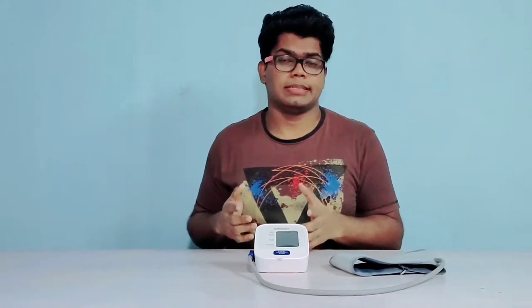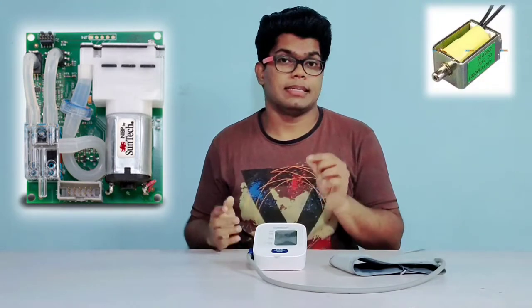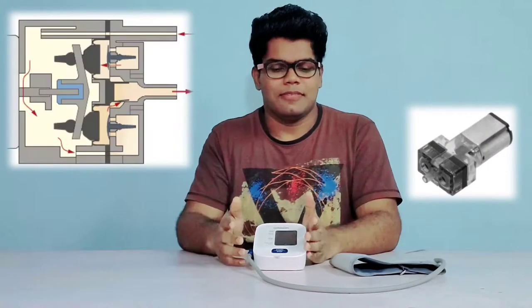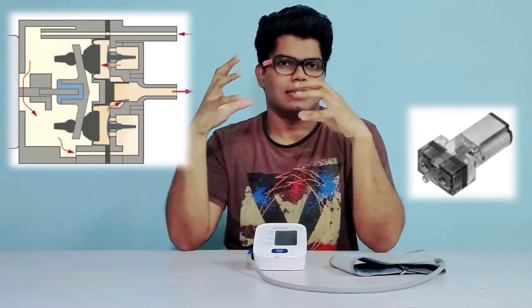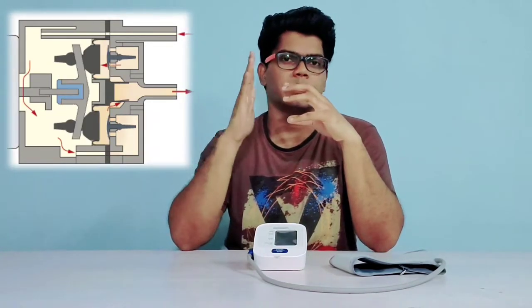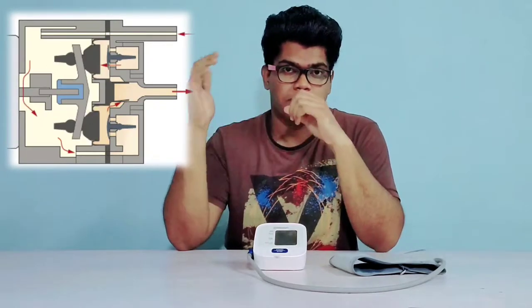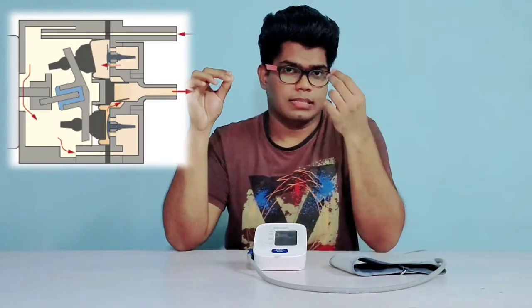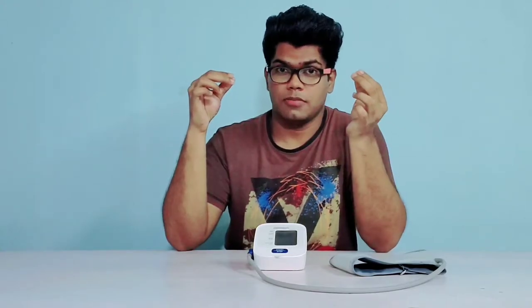Inside a typical blood pressure monitor, there is an LCD display, a microcontroller-based PCB, a solenoid valve, and a DC motor-driven diaphragm pump. The diaphragm pump is an interesting part — my favourite. When the motor spins, the shaft rotates an eccentric rotor. At the end, the diaphragm is connected. The eccentric motion of the rotor produces a reciprocating motion on the diaphragm. Two valves are present — the suction and discharge valve. As the diaphragm keeps reciprocating, the suction and discharge valves open and close. When the suction valve is open, the discharge valve closes.